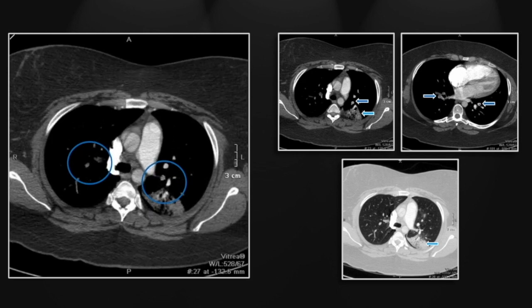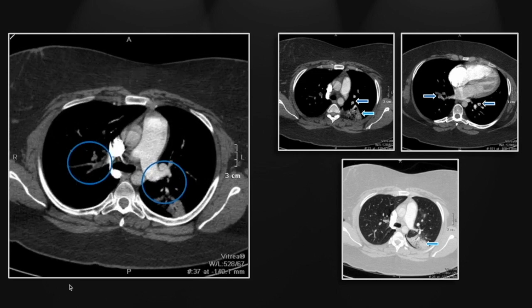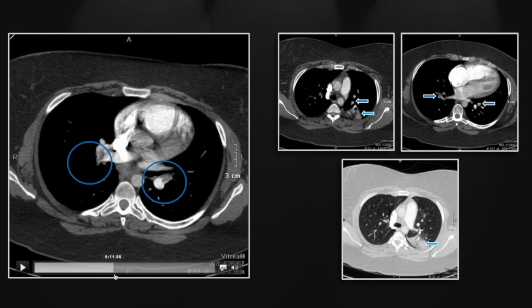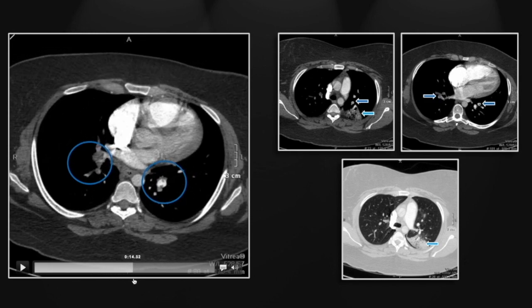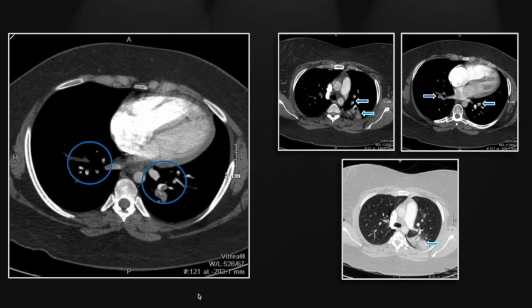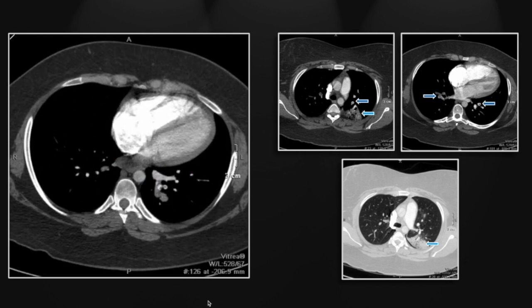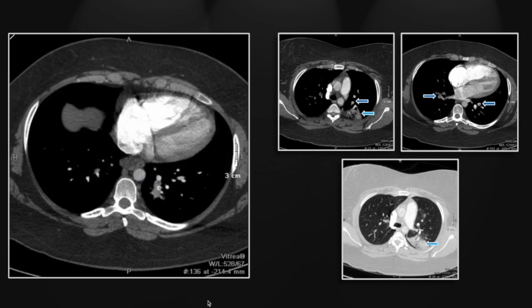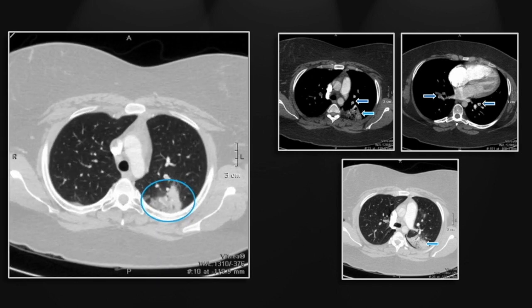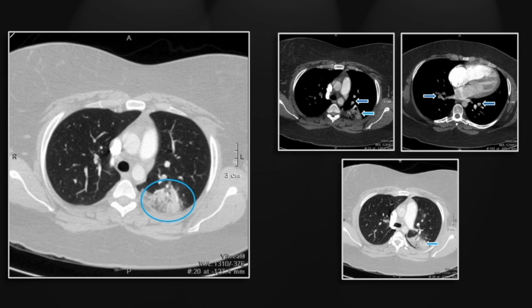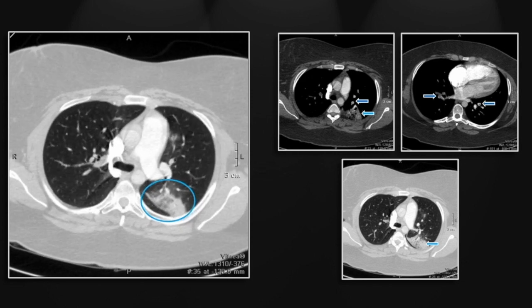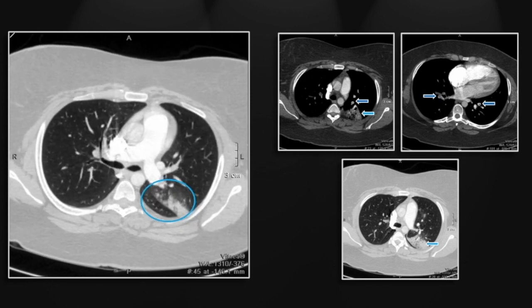There are the filling defects — we'll let that run so you can appreciate their extent — really involving every major pulmonary arterial segment. Again, you can appreciate the right ventricular strain. And on the lung windows, here is the largest and perhaps best demonstrated pulmonary infarct.